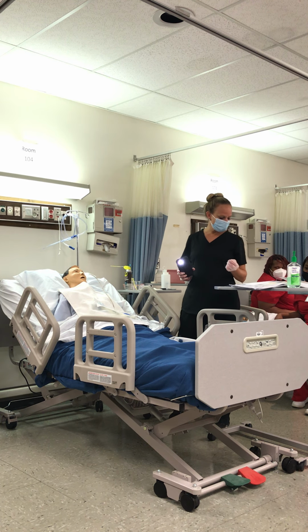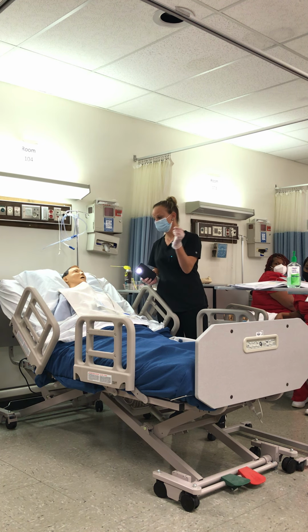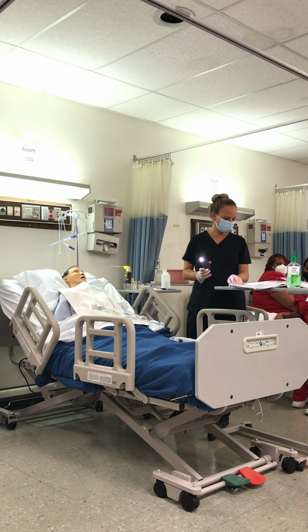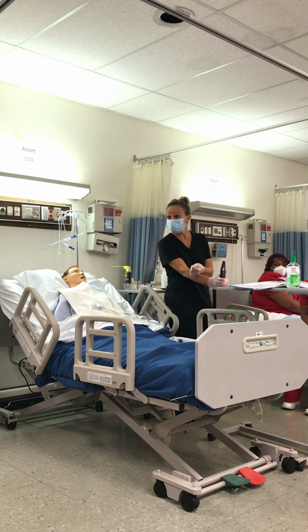So, we point that tip backward and downward, okay? Our patient is sitting up, but when we're putting this in, we want to go toward the back, trying to point down some. Now, if we met resistance, what would we do? Take it out? No, we pull back just a little bit. I'm not talking about taking it all the way out. You want to bring it back and then insert it in.